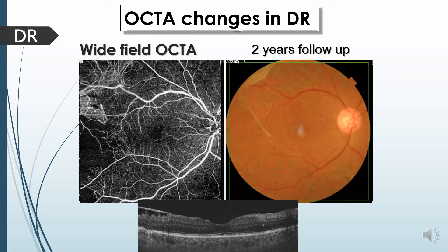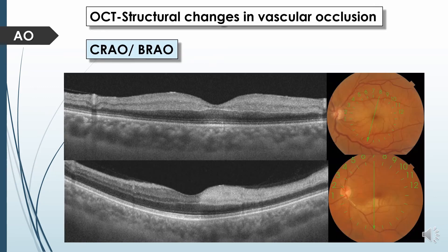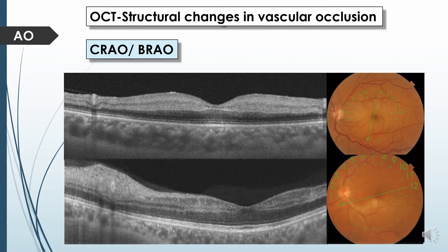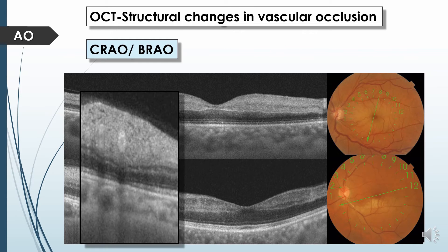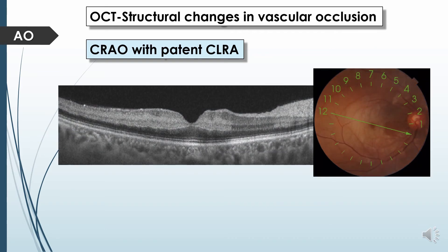Regarding retinal vascular occlusion: in retinal artery occlusion there is retinal whitening caused by ischemic infarction of the affected part of the retina. In B-scan OCT there is hyperreflectivity of the inner layers compared to the outer retinal layer. In some selected cases we can detect the fibrin thrombus plaque within the cavity of the retinal vessel. In a patient with central retinal artery occlusion with patent cilioretinal artery, B-scan OCT shows a discrepancy between the normal inner retina supplied by the cilioretinal artery and the hyperreflectivity of the inner retina of the rest of the macula.